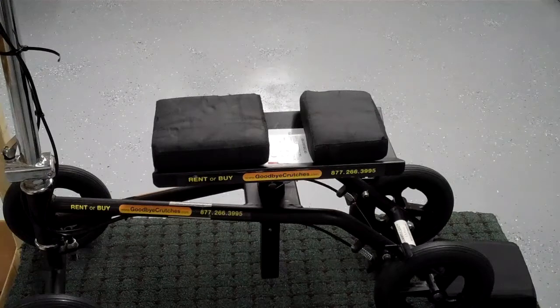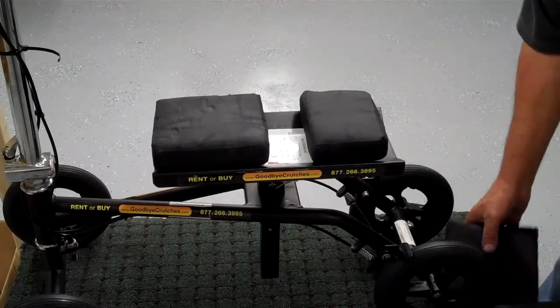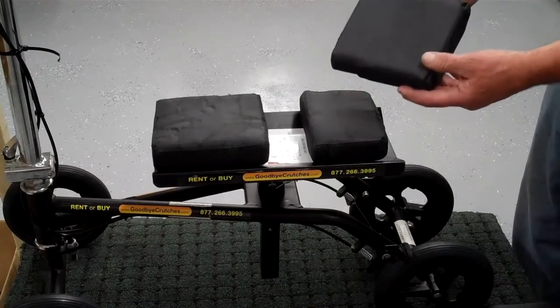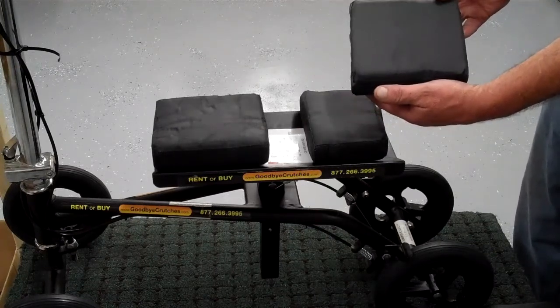Your pads may have just worn out, or you might have gotten the older pads that were very hard and wanted to upgrade to a better softer pad. The older ones we commonly refer to as the bricks. The new pads are soft but supportive and a water-resistant vinyl.